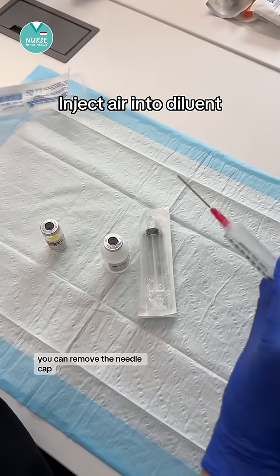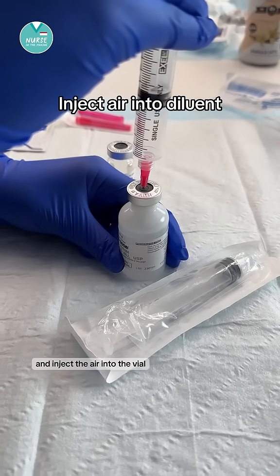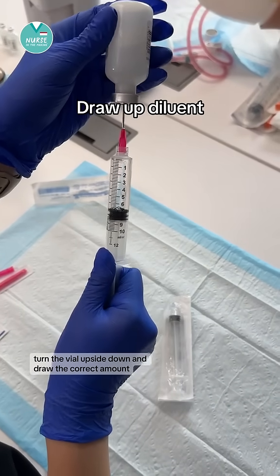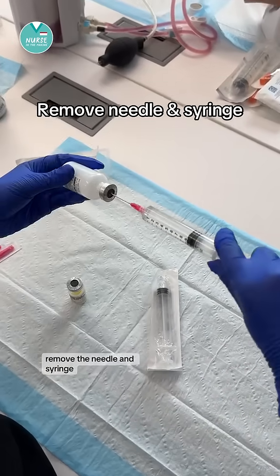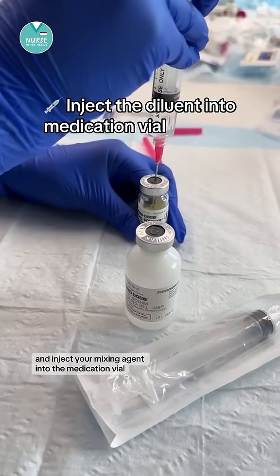You can remove the needle cap, keeping the saline vial on a hard surface, and inject the air into the vial. Turn the vial upside down and draw the correct amount. Remove the needle and syringe and inject your mixing agent into the medication vial.